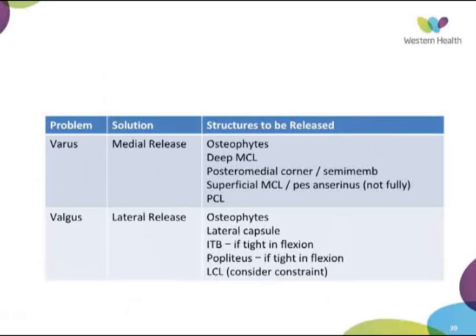There are a number of structures that can be released to achieve this, and that needs to be done in a sequential manner, but we need to be careful of over-release and destabilizing the knee.